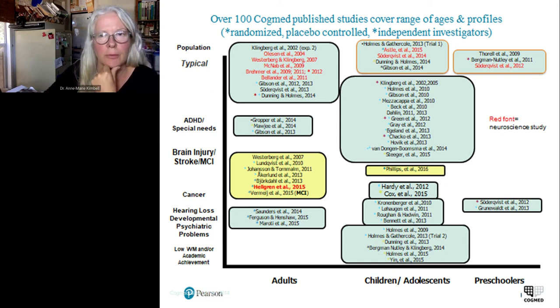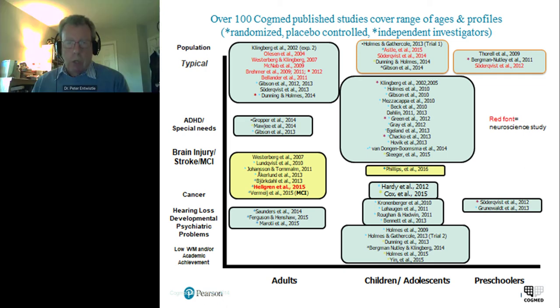Peter, and one of the things I would say is if you screen the patient, you can see what it is they need to do. And if you find the lower scores on that screening, that's perhaps where you want to start. So you may need to start with a simple attention task and make sure that the patient gets the therapy module for that simple attention before trying to take on other tasks that may involve executive functioning or memory.